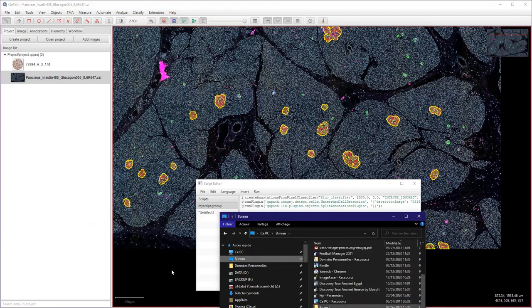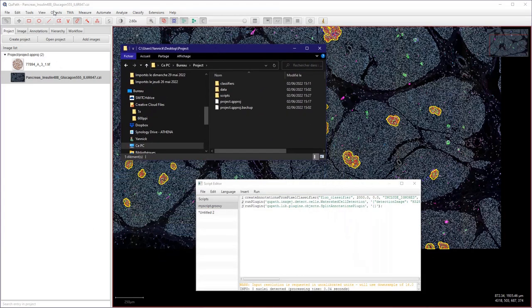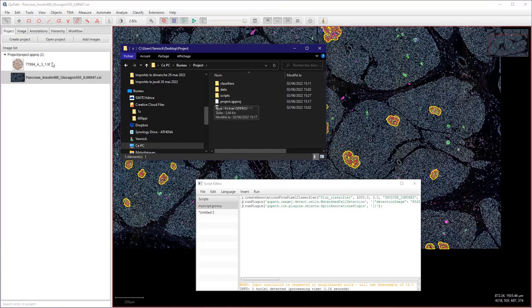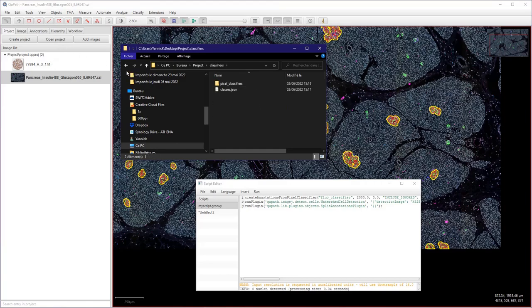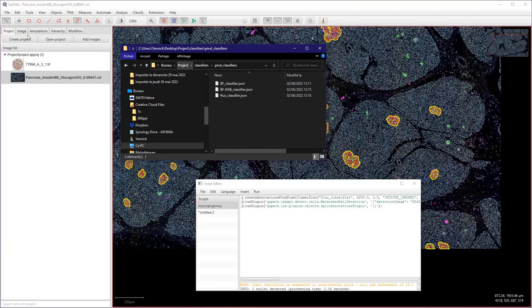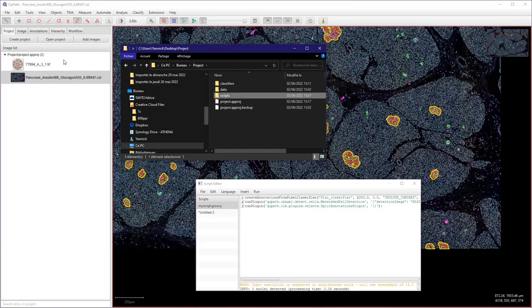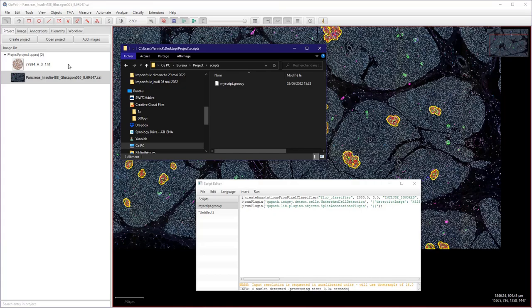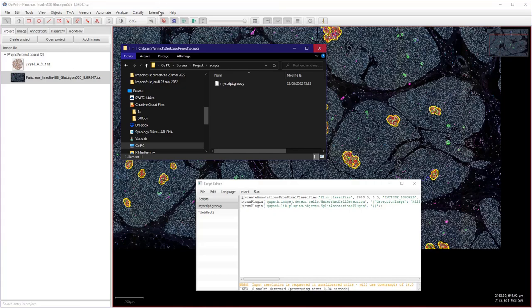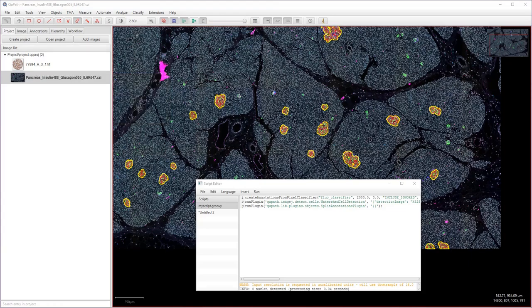I have a project folder here and classifiers are actually stored inside the project here. So if you don't have the project classifiers, the data, the scripts you have here, they won't work. So this was just quickly to show you behind the scenes how it works.